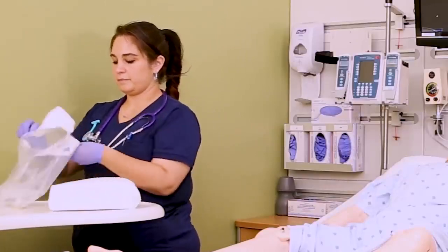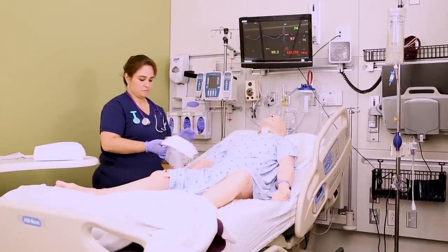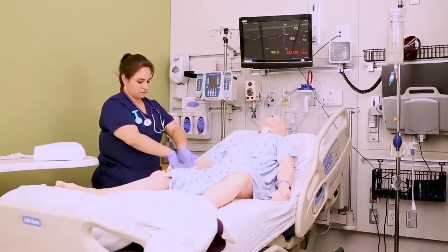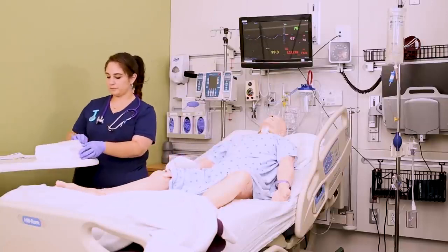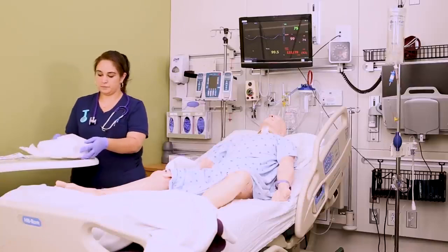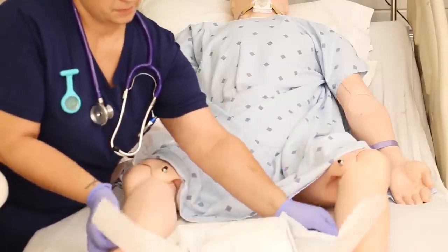Open the Foley kit and remove the package from the plastic bag. These plastic bags are great because once you get the kit out, you can fold the top of the bag over and turn it into a little trash bag, and just place it right next to the patient's hips near you. You don't want it too far away because you don't want to break sterile field to throw things away.